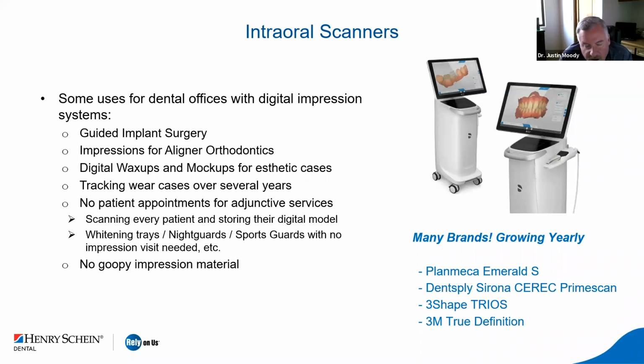The scanners start in my private practices by being part of the new patient experience. That includes taking a full arch intraoral scan of both arches. And what I now have is their models, and man, I've got a basement full of stone models from when we took these and articulated them.